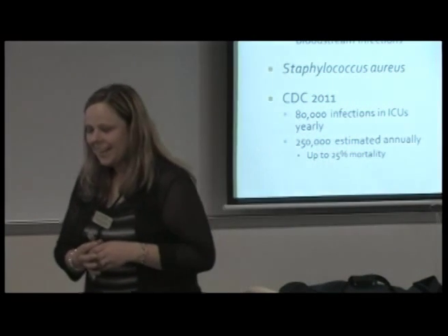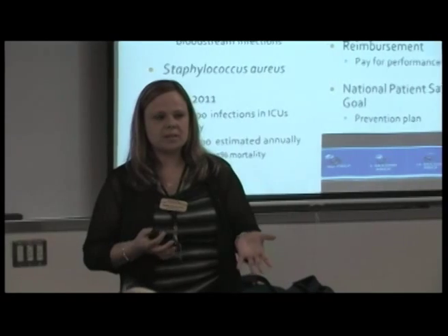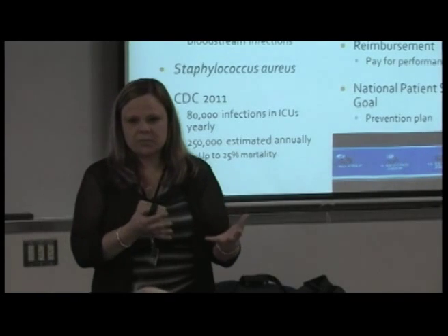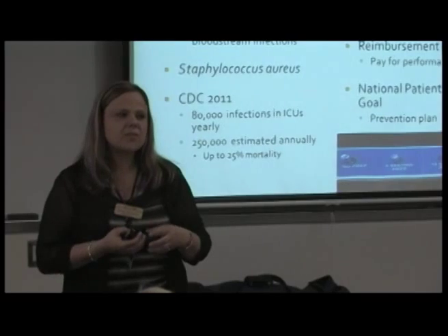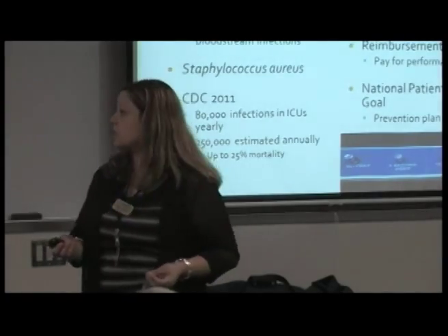Okay. It's supposed to be our secret. And when we're setting up new lines, that's something to consider. We know if the lines that we have set up are nice and clean and sterile, but when we go into a facility or we pick a patient up, we don't know if there have been alcohol caps on those. We don't know if they've been laying in the bed or where they have been, versus us taking something out of the package for the first time.